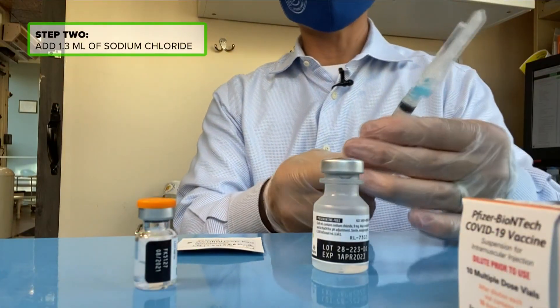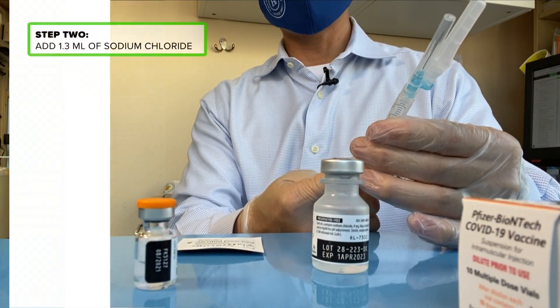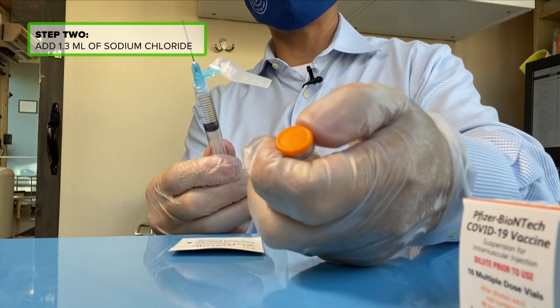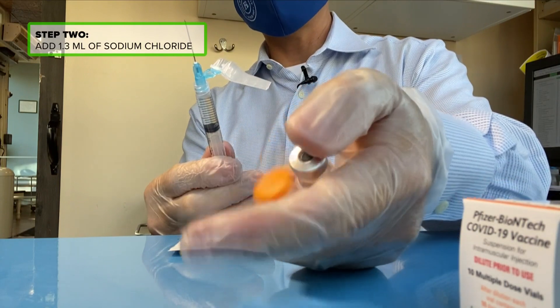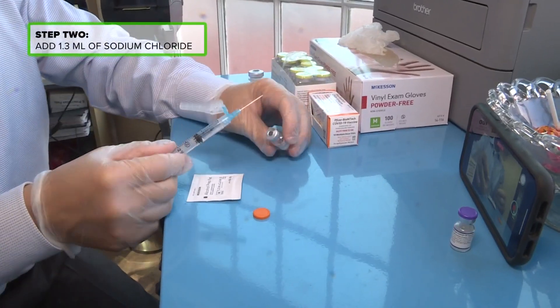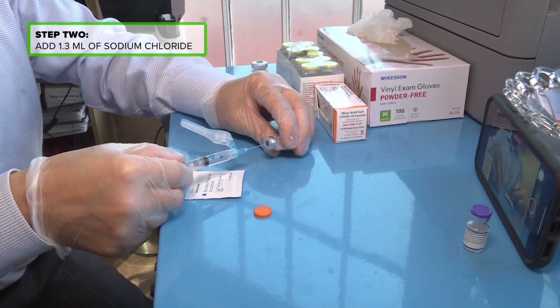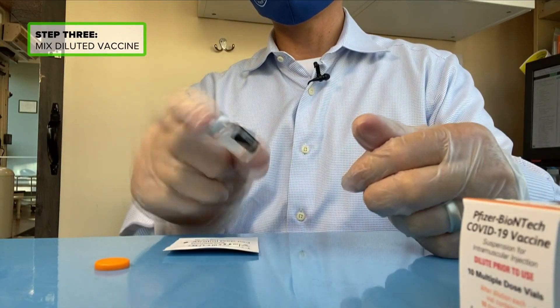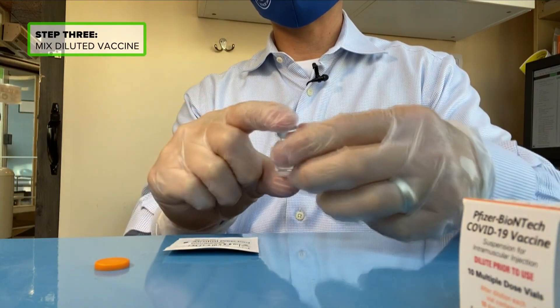Then we're going to take a syringe. The next step is the dilution process, using 1.3 milliliters of sodium chloride. We're going to take the vial of the actual COVID vaccine and add this 1.3 milliliters to the vial.